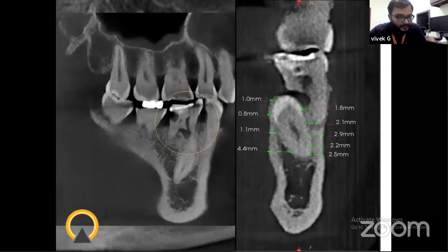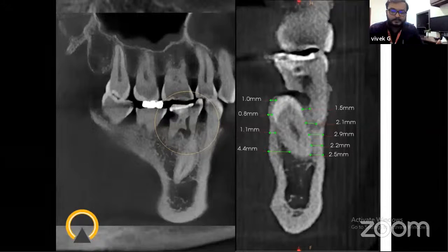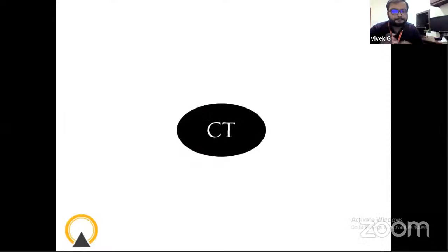And in the sagittal section, we can see that even though there is a caries process happening on the distal aspect of the molar, the interradicular radiolucency is because of the presence of the supplemental tooth, which is causing the lingual resorption of the mesial root. So the treatment plan would completely change, from going for an endo treatment to maybe sometimes having to sacrifice the tooth itself. So again, the 3-dimension adds to the 2-dimension.